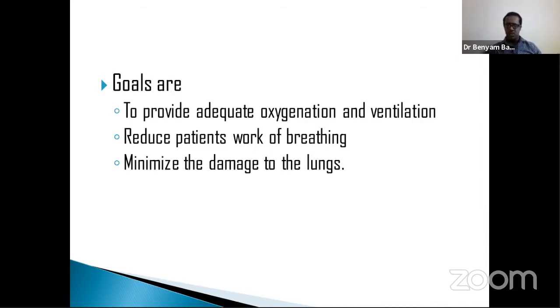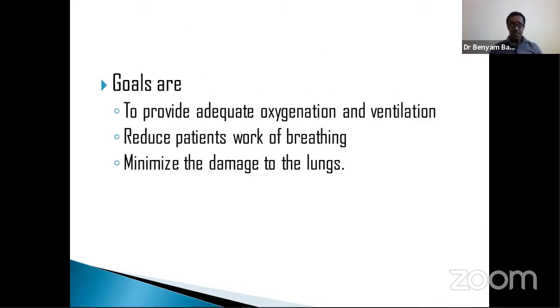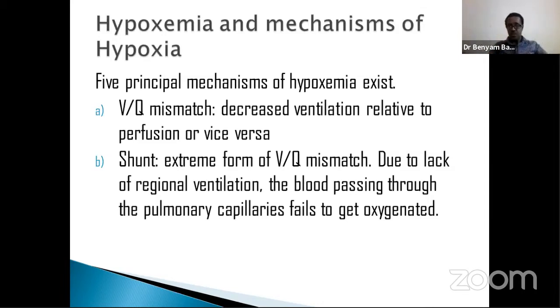And Jillian mentioned a lot of indications, including acidosis, or metabolic acidosis or respiratory acidosis. Other causes are not mentioned, but the commonest causes are relatively related to this. So we agreed hypoxia being low oxygen saturation or low blood oxygen pressure, that is less than 60 millimeters of mercury, or saturation less than 90%. So usually, understanding the mechanism of hypoxia is important, because depending on that, the setting of our ventilator might vary. And those classifications are obviously there to better understand the underlying problem. And there might be overlap between those classifications. So those classifications exist for studying purposes. So always know there might be some overlap in between.